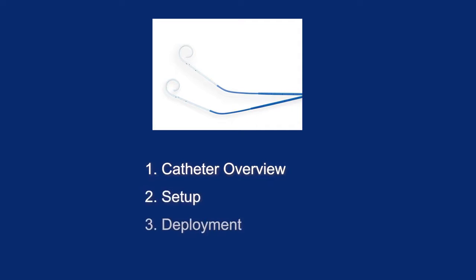Welcome to the Langston Catheter in-service video. In this video, we will review the catheter overview, setup, deployment, and tips and troubleshooting.